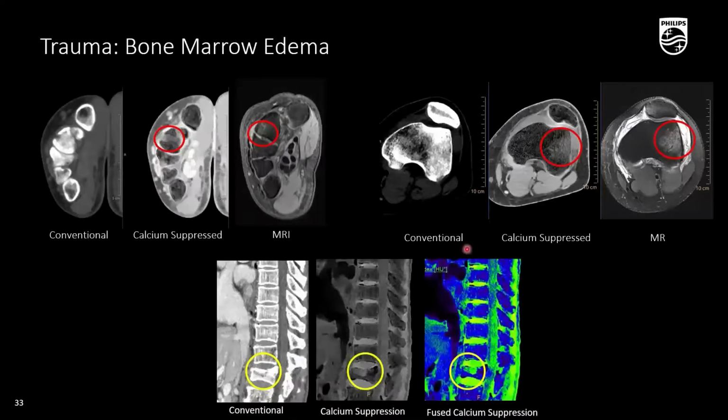And then again here, this isn't an MRI, it's just fused together, but again, the image in the spine. So, okay, we can tell where the fracture is, that's not a problem, but is it new? And here we know, yes, it is. We can see the edema.